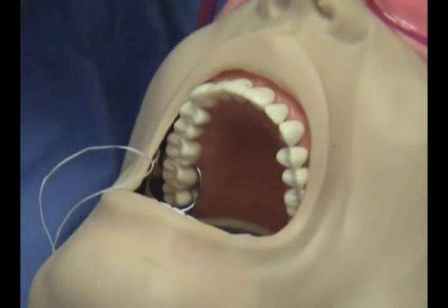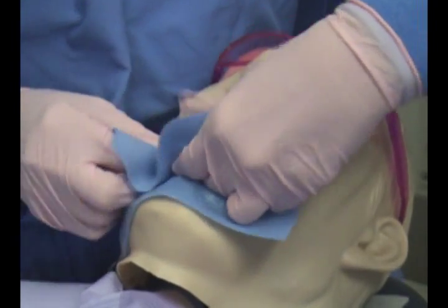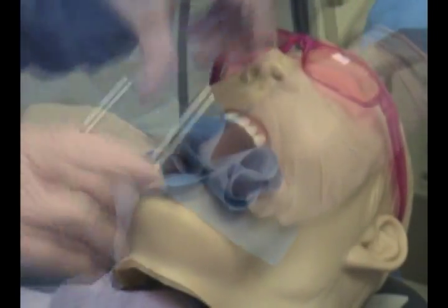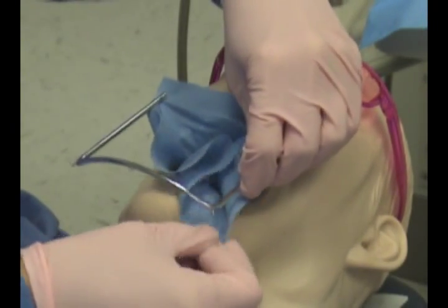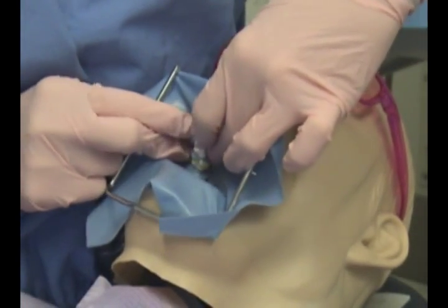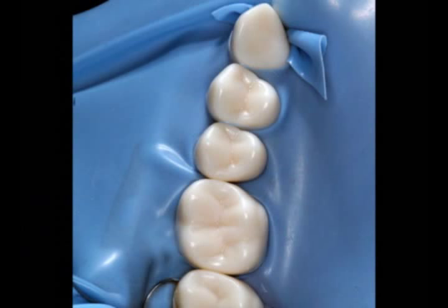With the clamp in place, we will now place the rubber dam on our patient. Being a great assistant, you are probably noticing that we are using the rubber dam that you pre-punched before the procedure started. A metal frame will now hold the rubber dam in a stretched out position, and the rubber dam material will be stretched to isolate each individual tooth. Here we can see the rubber dam placed on quadrant 1.